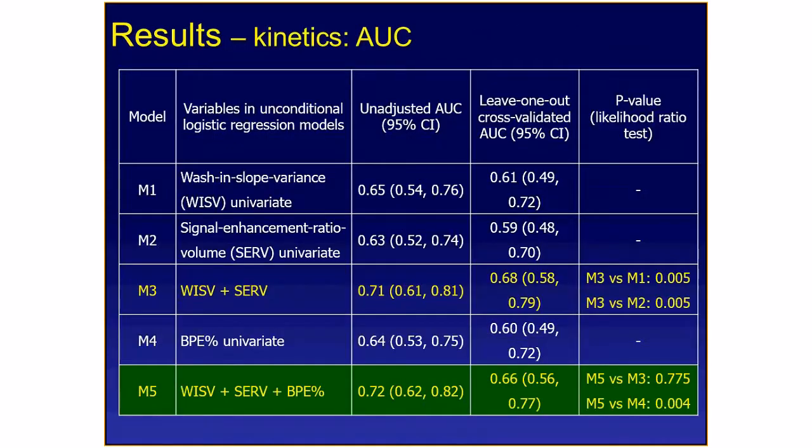And again, in terms of AUC, if you look at it here, BPE is about this number, kinetic feature is about this number, and you put them together, these numbers. Again, here is only the imaging features. We are not considering other features.